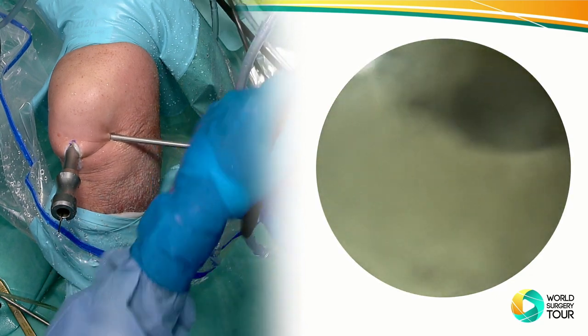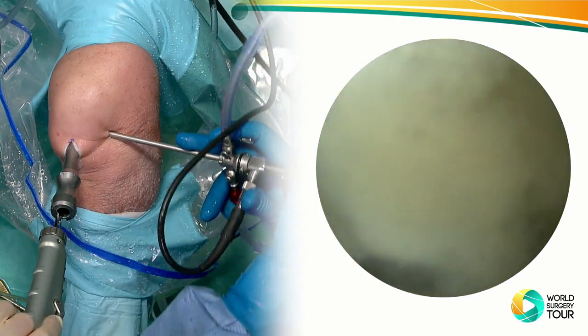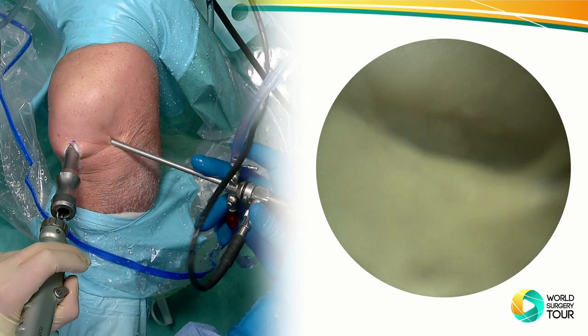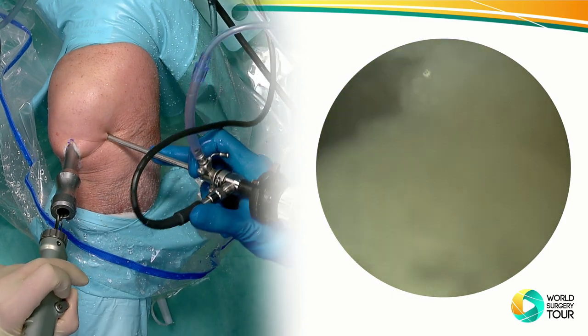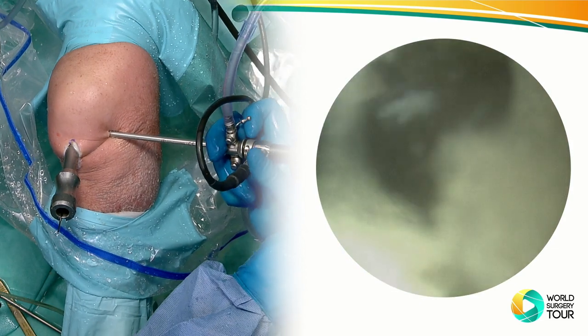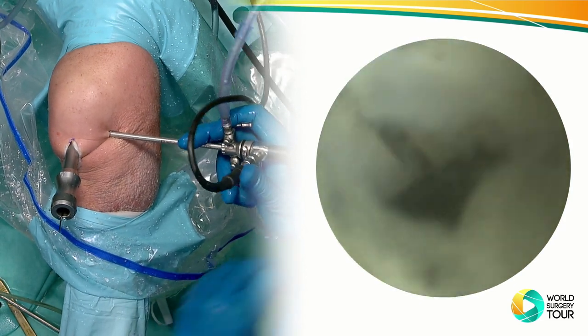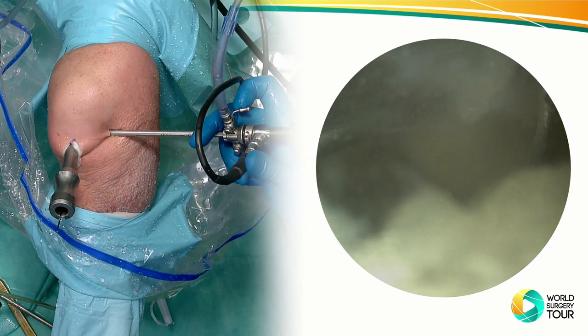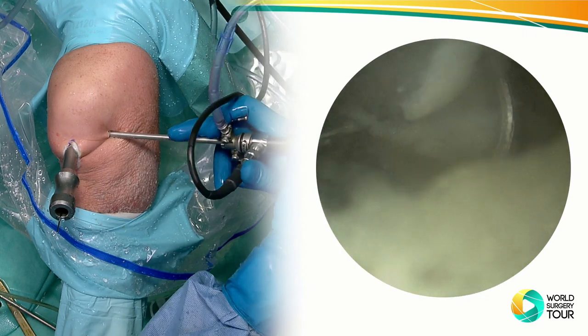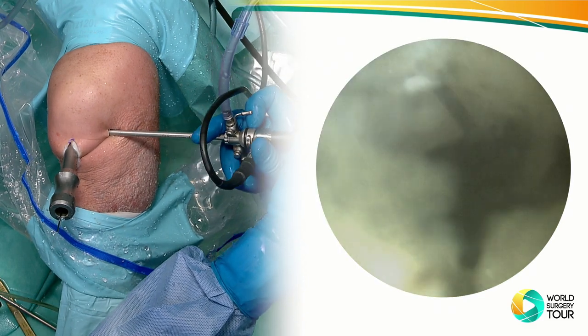Doesn't work with this here. We have a pump. Makes it difficult to remove the whole thing. Wait. Yeah. Can you put in the suction, please? Ah, okay. You had no suction on the shaver, that's why.